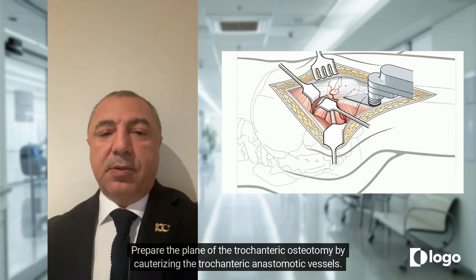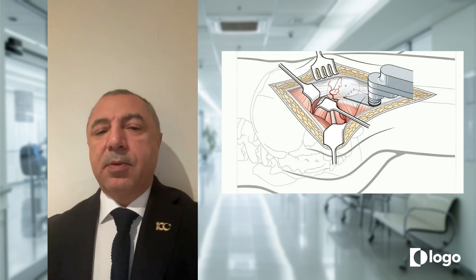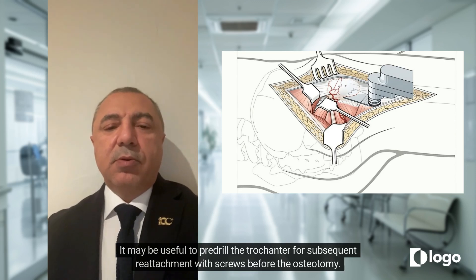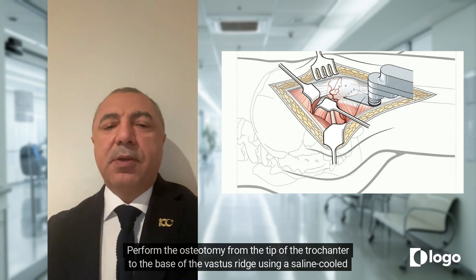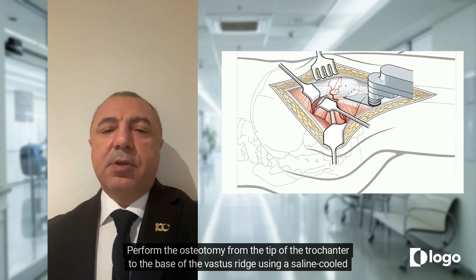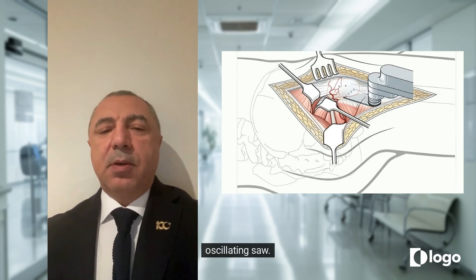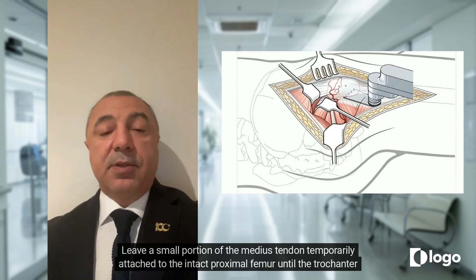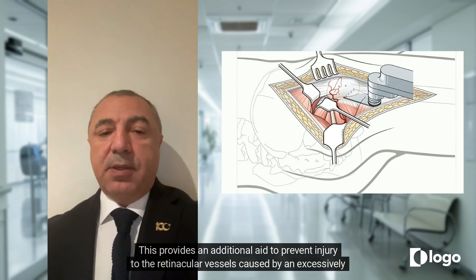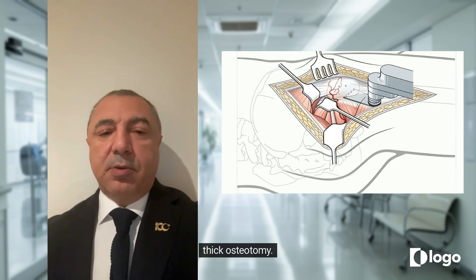Prepare the plane of the trochanteric osteotomy by cauterizing the trochanteric anastomotic vessels. It may be useful to pre-drill the trochanter for subsequent reattachment with screws before the osteotomy. Perform the osteotomy from the tip of the trochanter to the base of the vastus ridge using a saline-cooled oscillating saw. Leave a small portion of the medius tendon temporarily attached to the intact proximal femur until the trochanter can be mobilized. This provides an additional aid to prevent injury to the retinacular vessels caused by an excessively thick osteotomy.